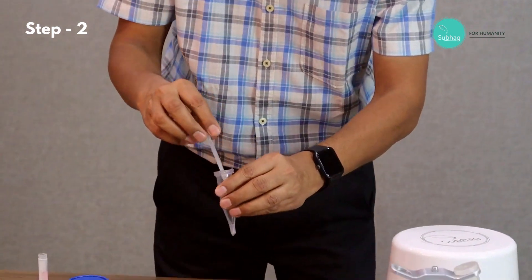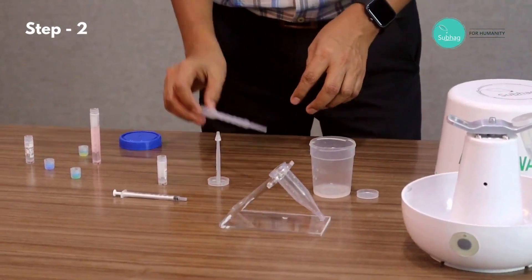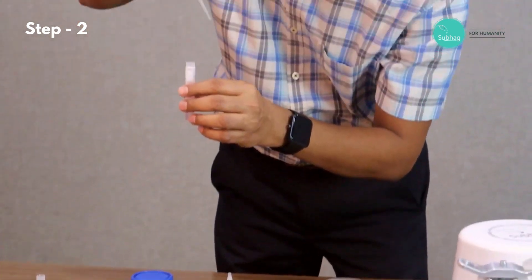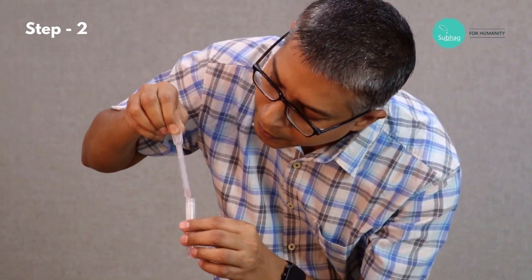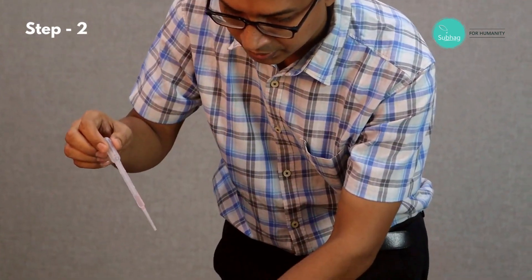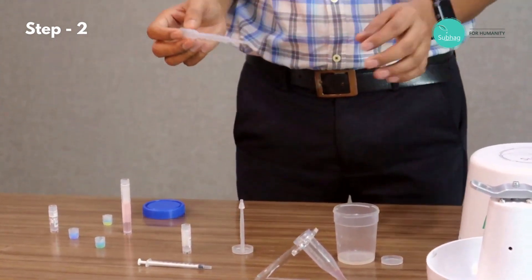Now we remove cap three and put the tube back into the stand. Then we add 1 ml of culture medium for the second stage washing. Now we don't need to bother about the speed as we are not making any layer. Now we are ready for the second wash.